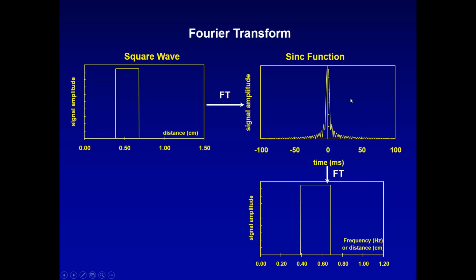If we take the sinc function, which is what our K-space, our raw signal from an MR scanner, would be, when you do a Fourier transform, you get the box back. If we make the box wider, you may think about that for a moment, there's a longer flat area. So the part close to zero on this sinc function will be bigger compared to the edges. If we make this box very short, very brief, now there's a very small flat portion.